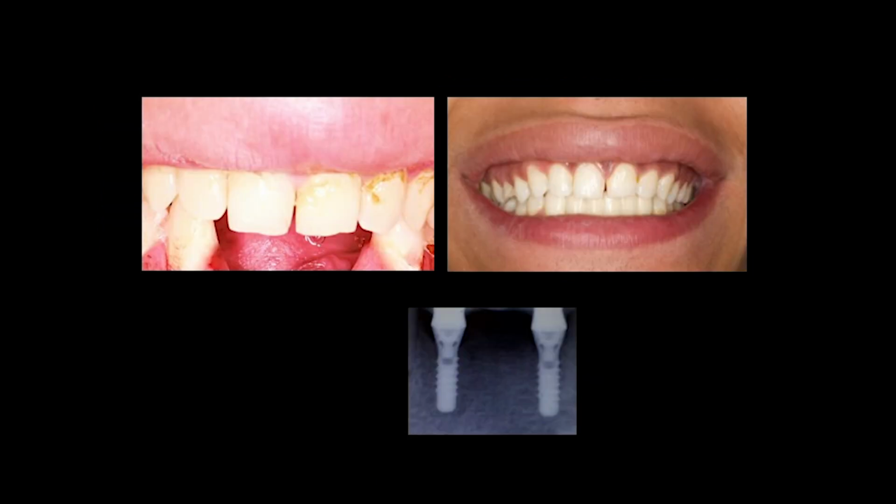This is after 4 months of healing. You see the bone that has been formed. So the screws and the plate were removed, the implant was placed, and this is after 3 years of healing. Excellent healing for this patient. His life is totally changed.